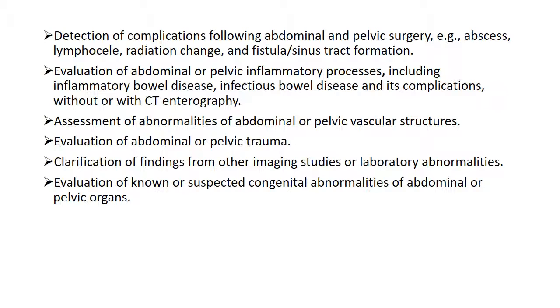Evaluation of abdominal or pelvic inflammatory processes, including inflammatory bowel disease, infectious bowel disease, and its complications without or with CT enterography. CT is great at seeing the bowel wall and seeing several abnormalities with the bowel. Assessment of abnormalities of abdominal or pelvic vascular structures. And again, it does see vascular structures very good. You can even see plaque formation or any blockages that occur within the vascular system.